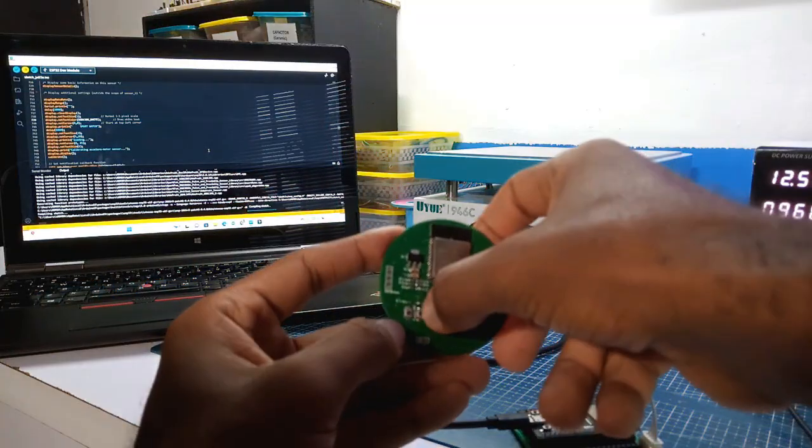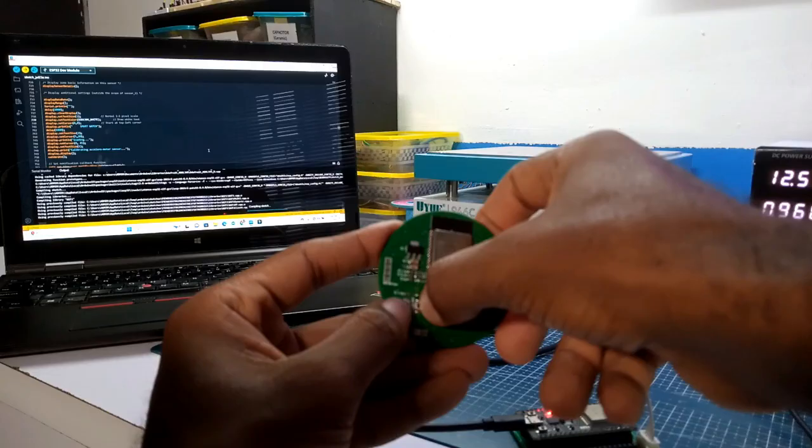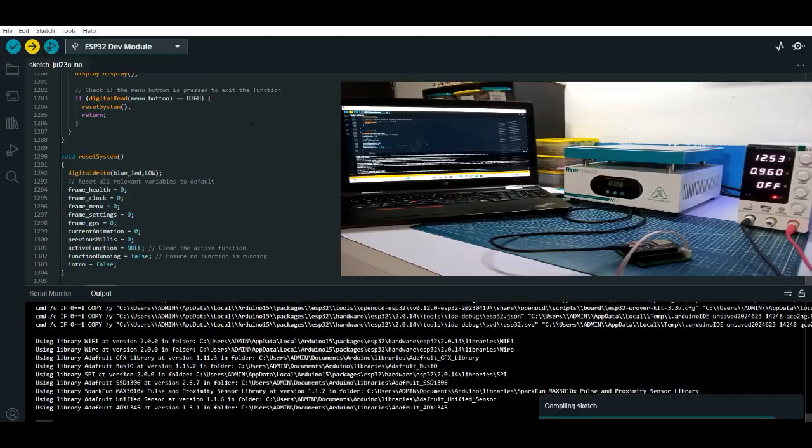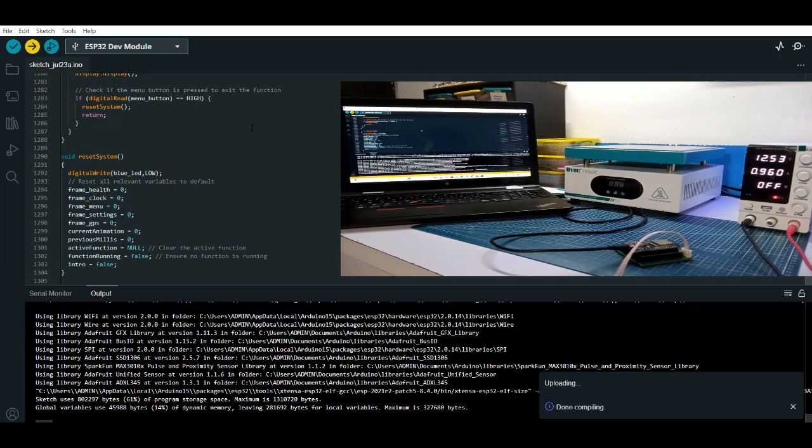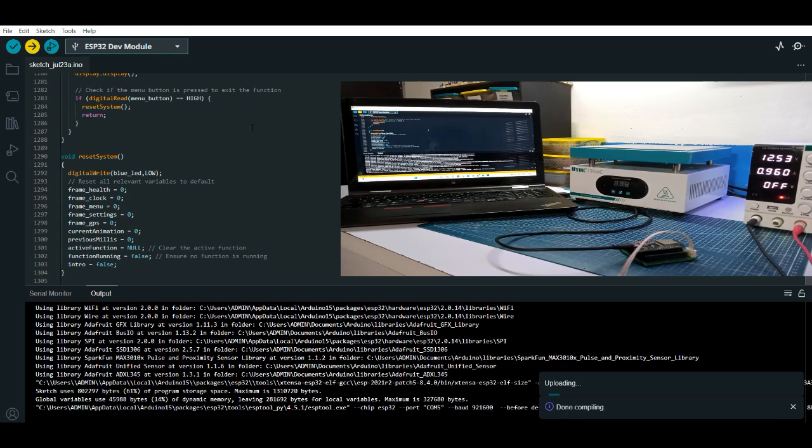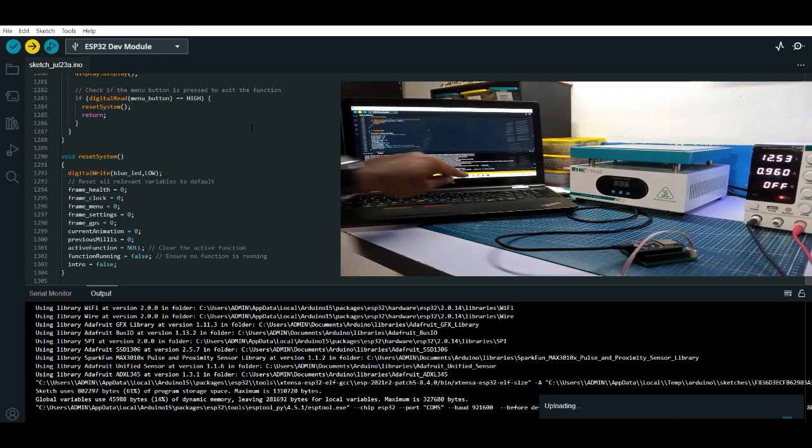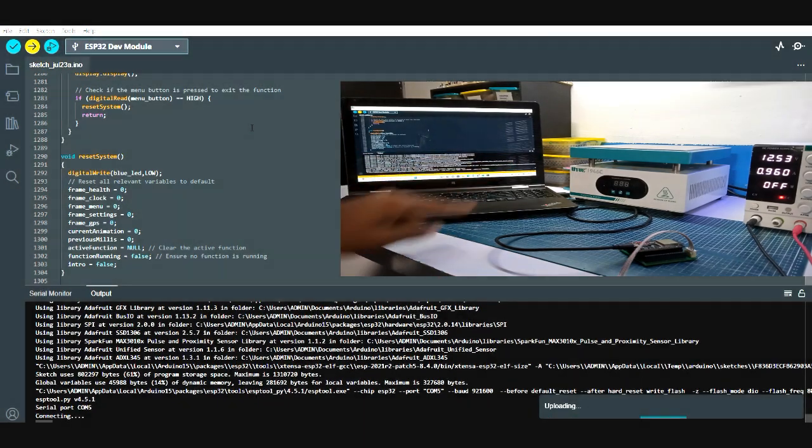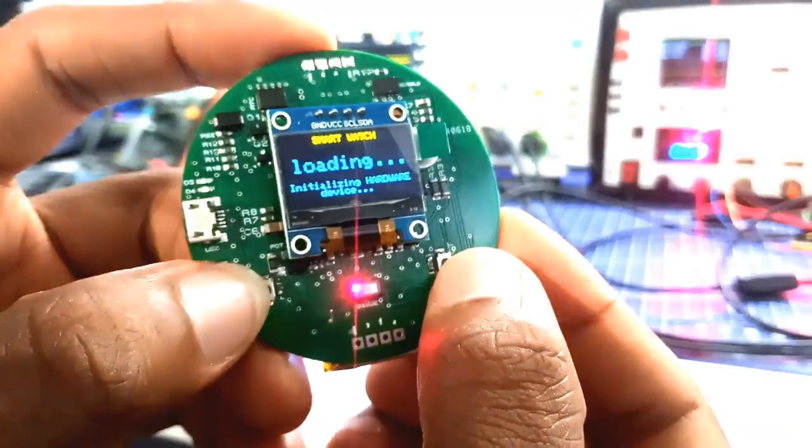I now uploaded the last program which integrated all functionalities such as the heart rate check, GPS, watch, and more. And with that done, we now have a working tracker system.